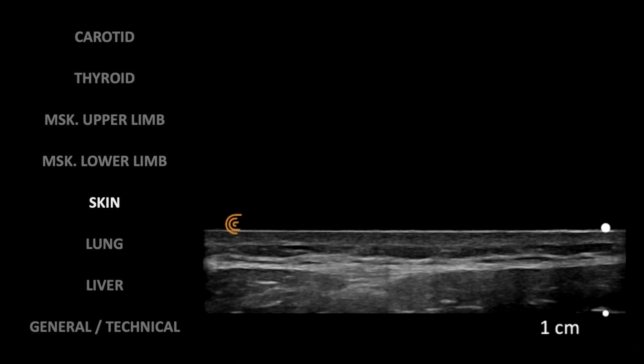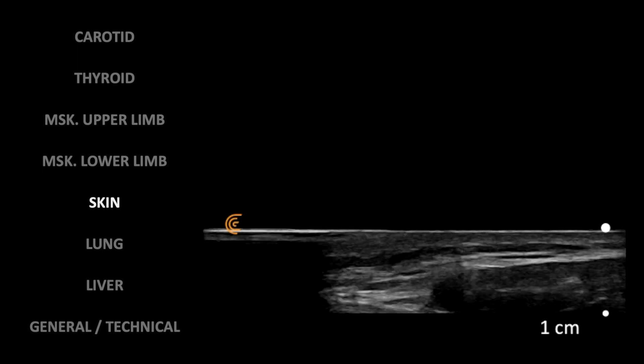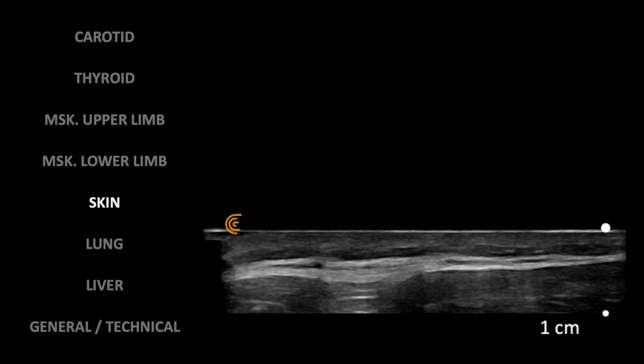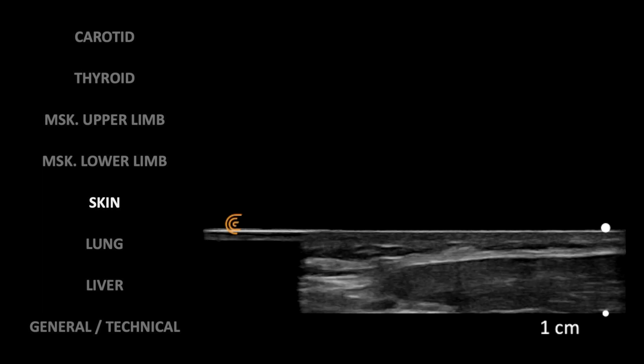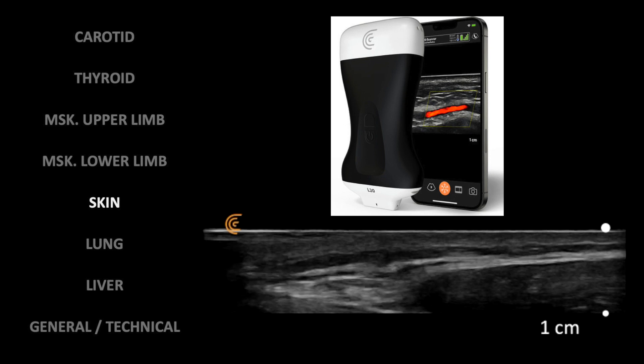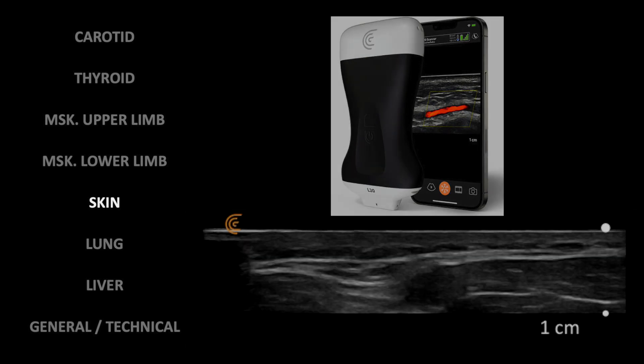Whether you need to do cosmetic procedures in aesthetic medicine or assess nodules or tumors in dermatology, there is a skin preset for a 1 cm field — although Clarius has a better device for these cases, the L20, which emits up to 20 MHz while this one emits at 15 MHz.